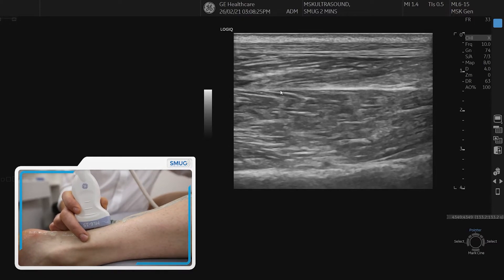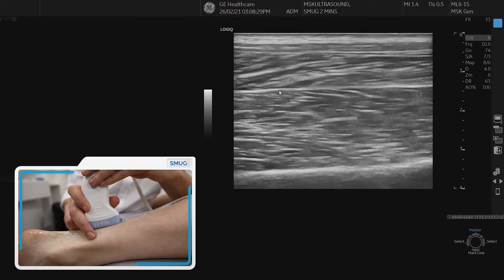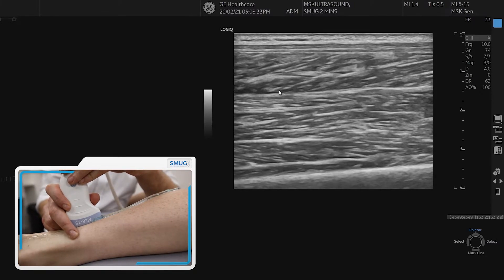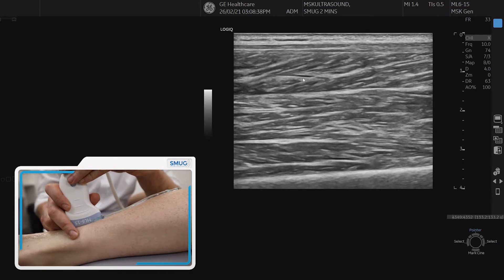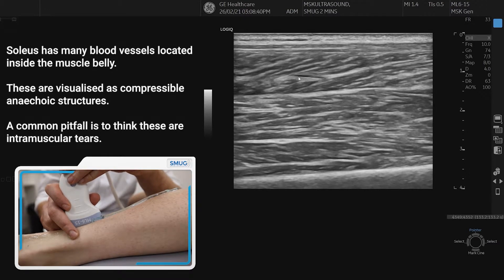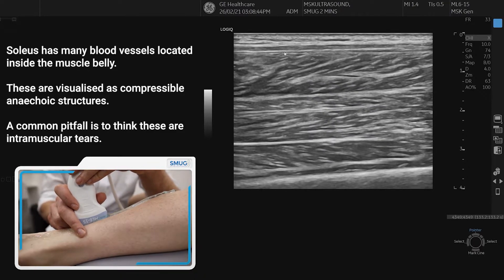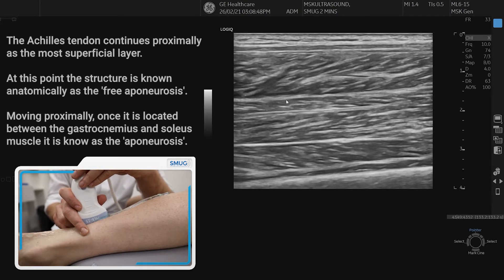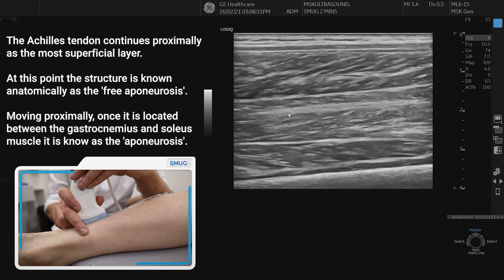The next angel cake layer is the most proximal. Moving further up, it's important to note that in the soleus there is a small vessel — a small vein — and it's important not to call that a tear. We can still see the angel cake layer at the top of the Achilles, then soleus, and underneath, wiggling the big toe again confirms that is FHL.